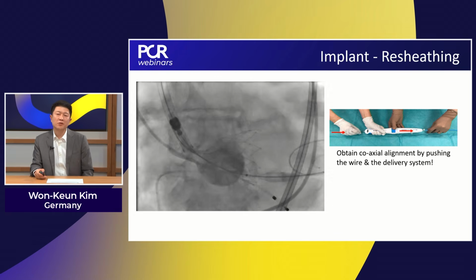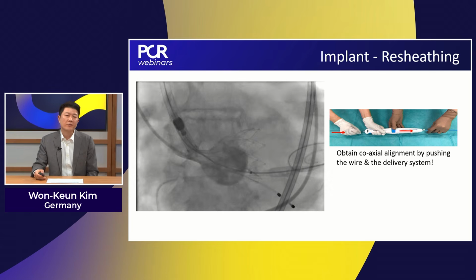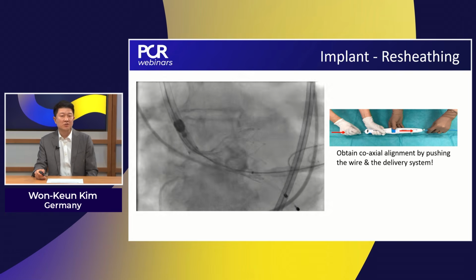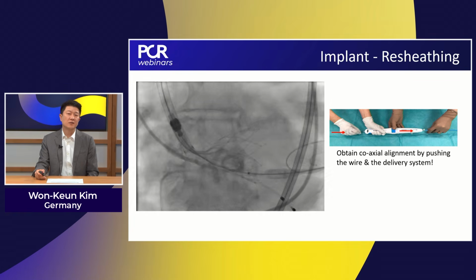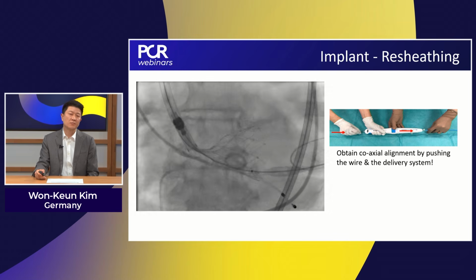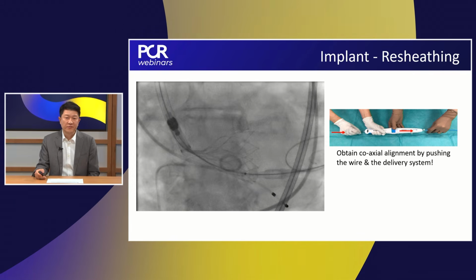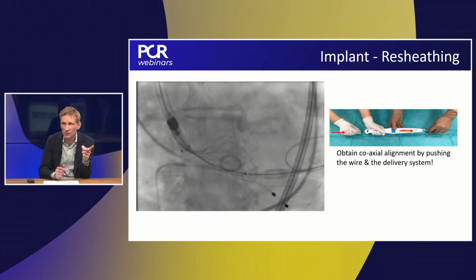And here in this angio, you can see the first position, and you can see we have reached the 80%, the safety knob. Usually at this stage, the patient is stable. You have sufficient time to evaluate the position, which is important. Look at the non-coronary cusp and the left coronary cusp. I think this was probably in some LAO angulation. With this position, we were not satisfied, and we tried to resheath.